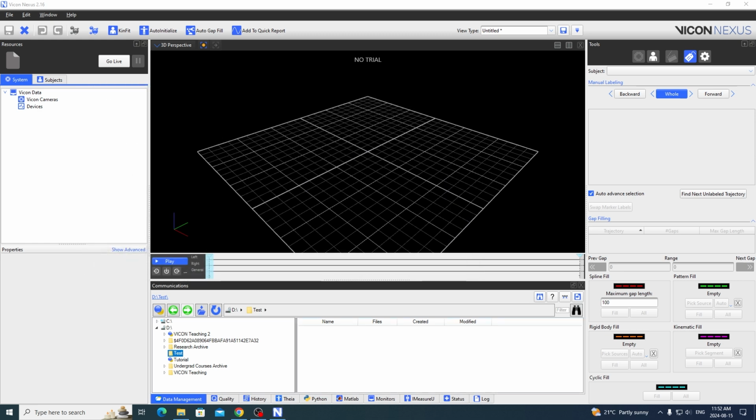And now you'll notice that this tutorial folder is actually a special folder which has the ProEclipse symbol, which is the same symbol as this one right here. If I click here, again, this is still empty because we don't have any files yet. But what is different is we have this button right here, which is called Create a New Patient Classification.